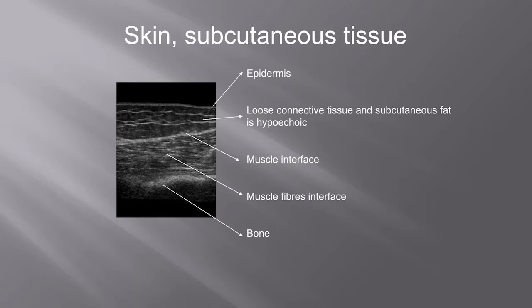If this were a finger, this would be a very fat finger, but if it were a finger and you were trying to look for a fracture, you would see a break in this little hazy line here, all right? Muscle tear, you'd see a black line going through here, all right? And of course, abscesses or laceration, you'd see there.